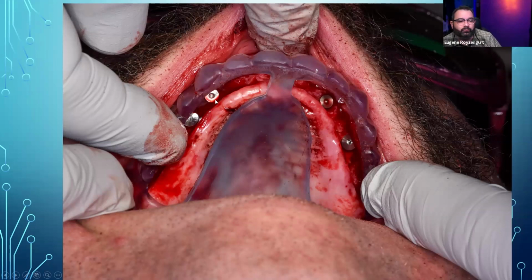And when we surgically plan these things, I tell them we need to do this much bone reduction. They know that, but they also will know that around the canine, we have this much bone, so this is the best possible area for this particular implant. So they will line it up on the surgical guide and they'll start doing around the canine. So these teeth are also kind of like markers that show the dentist, in comparison to the CT scan, where it's best to place those implants. I hope it makes sense.